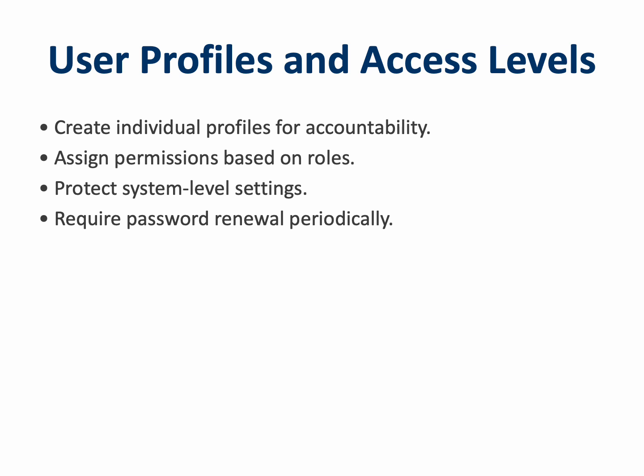User profiles promote security and traceability. Each operator should have a unique login to track who performed which tests. The Rigel 288 Plus allows you to define access levels. For example, basic users for routine tests and administrators for configuration and calibration. Limiting access prevents accidental changes to system settings. Require password renewal every few months to align with cybersecurity best practices. In multi-user environments, clear separation of permissions enhances audit readiness and reinforces responsibility. This structure turns accountability from a burden into a built-in safety mechanism.